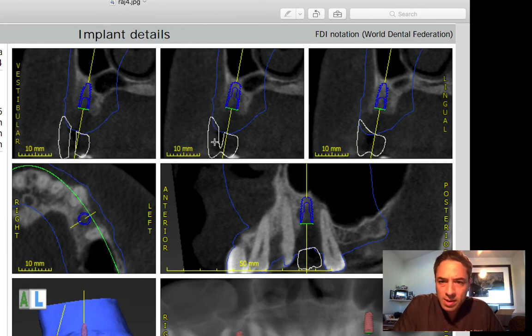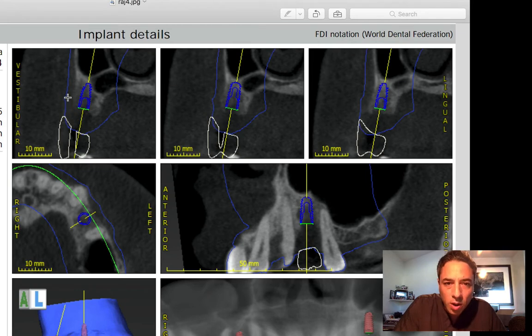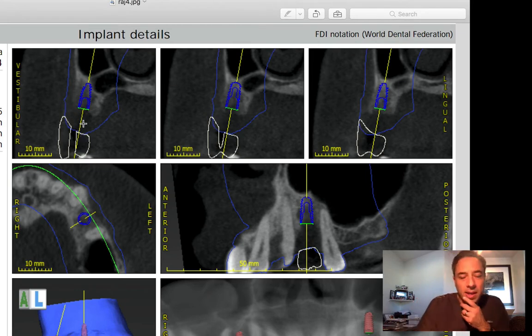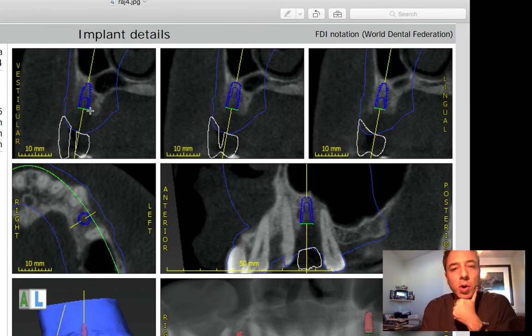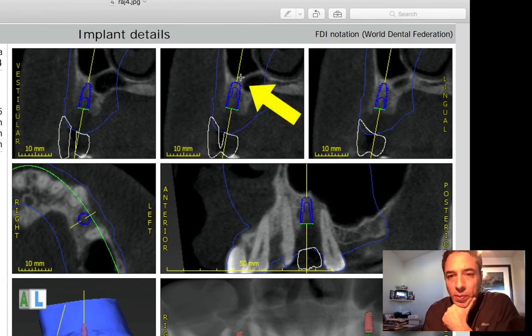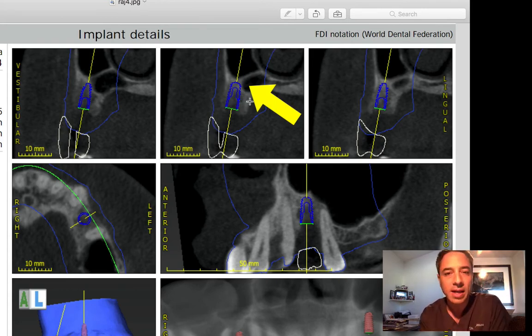In terms of screw access, I would probably tilt the implant a little bit slightly to the buccal, so you are coming out right from the central fossa. The bone quality on the buccal is not 100%, so you have to be careful in terms of stability. So where are you going to get your stability from? Mostly the apical area, which is cortical bone. And basically, you'll be engaging the floor of the sinus.